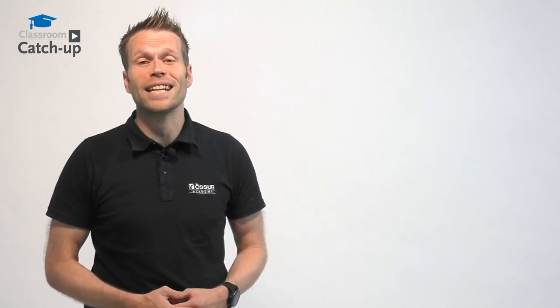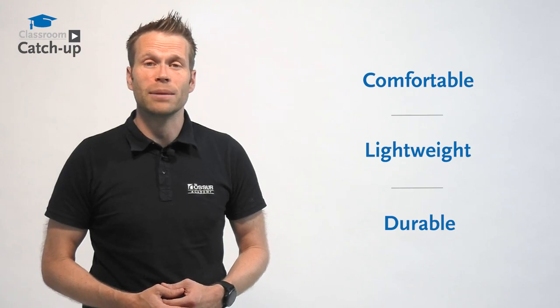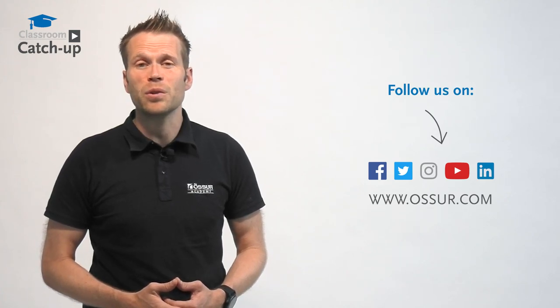We're really proud of the latest iteration of the CTI range. The CTI3 is a comfortable, lightweight and durable ligament knee brace which provides stabilisation of the knee joint, with an anatomical design suitable for everyday activities and sports. If you need further information, please contact your local area sales manager or us here at Össur Academy.